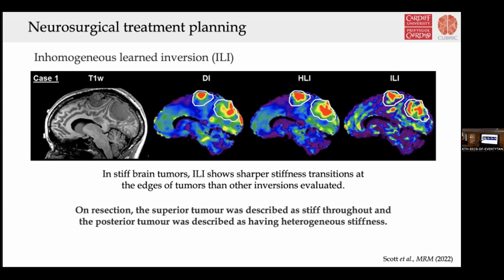The previous study I just mentioned used this technique, where we know from all kinds of results and simulations that this is much better. So when we think about looking at smaller tumours, this could be a lot more reliable with this method.